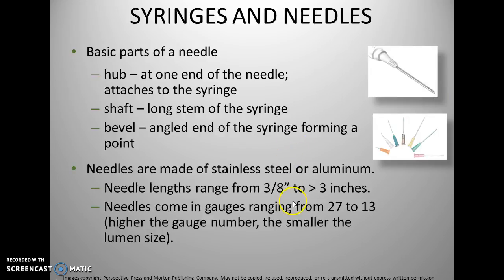Right, so needles can be in different lengths, as you can see here, from 3/8 of an inch up to 3 inches. And then you have different types of gauge, 27 to 13. The higher the gauge number, the smaller the needle size.